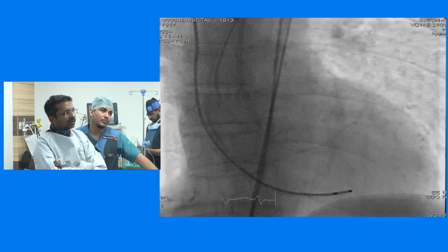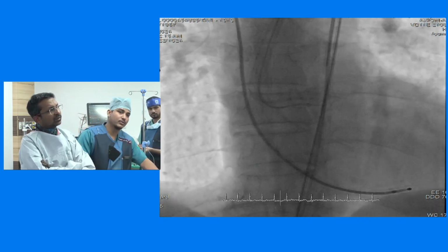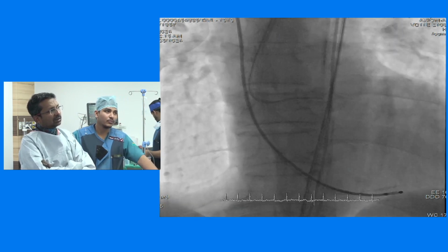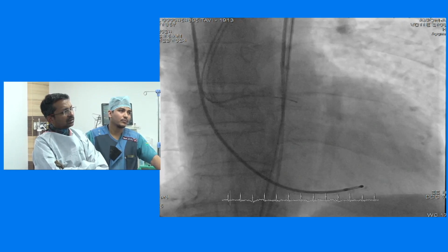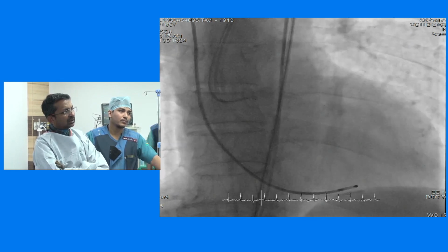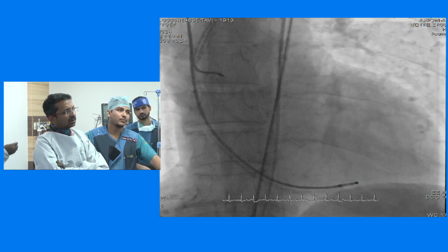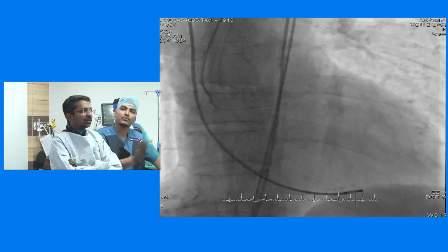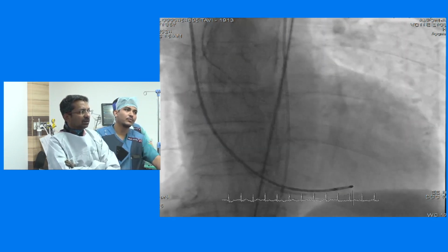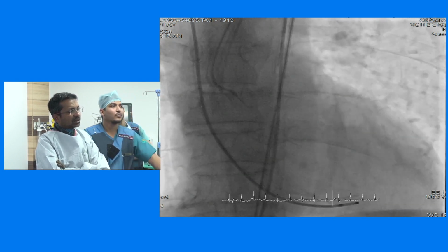Previous run. Yeah. It took some time, but give the fast forward.